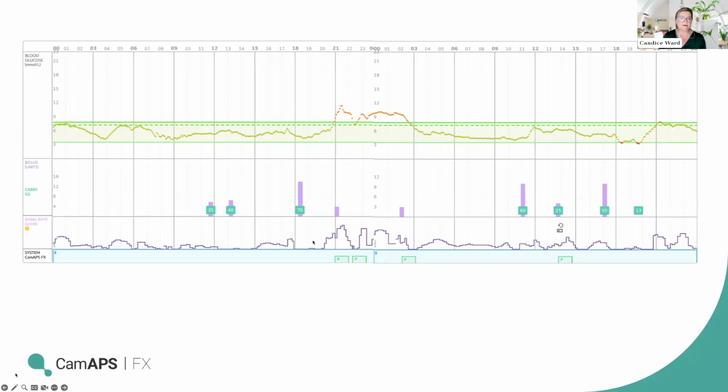And so if we look here, we can see that her bolus goes in. It's quite a large bolus for 70 grams of carbs, and you can see the algorithm has shut off again afterwards. And then she's risen after that point, with a correction and boost to bring her back down again. So it's kind of looking at these things. One, is it the volume of carbs?